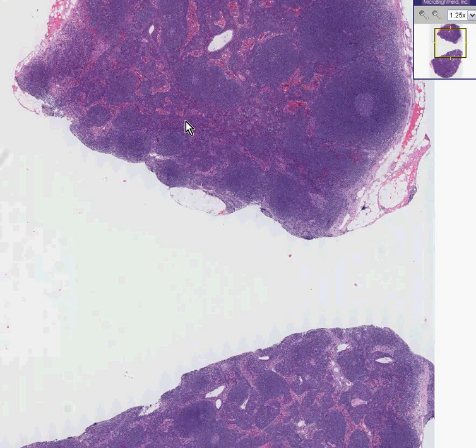This is called a mantle cell lymphoma, and the mantle zone of a lymph node is the area of small lymphocytes immediately surrounding the germinal center.